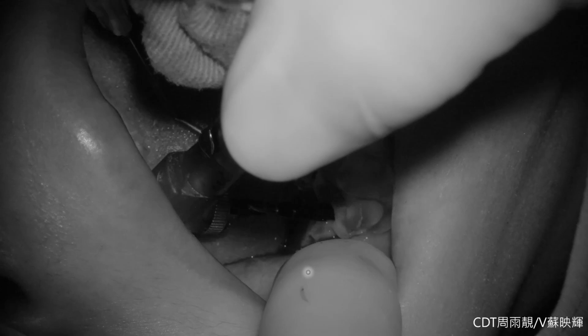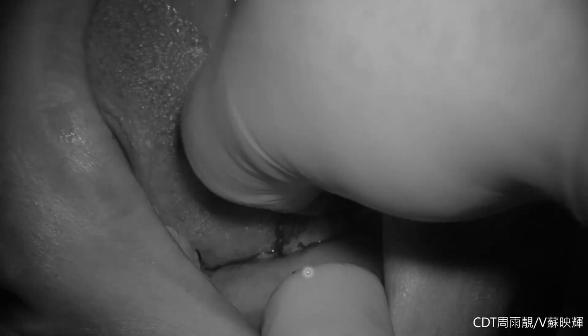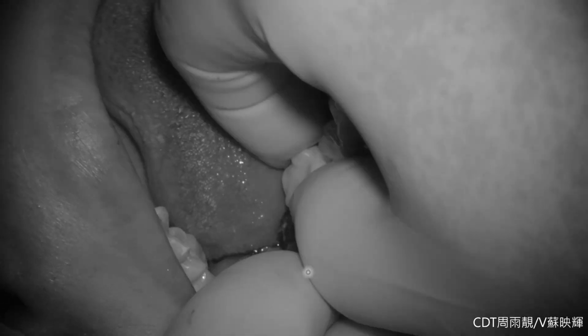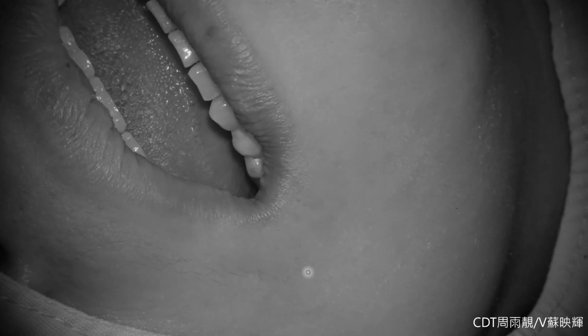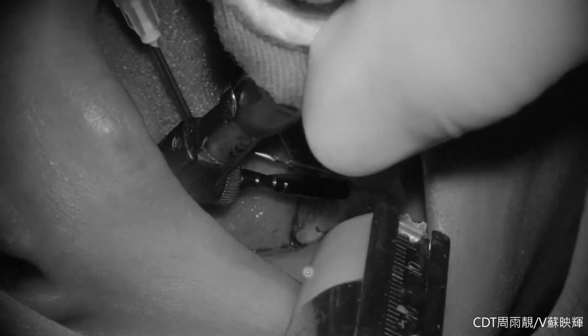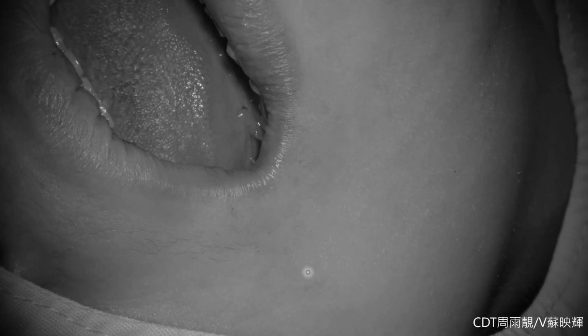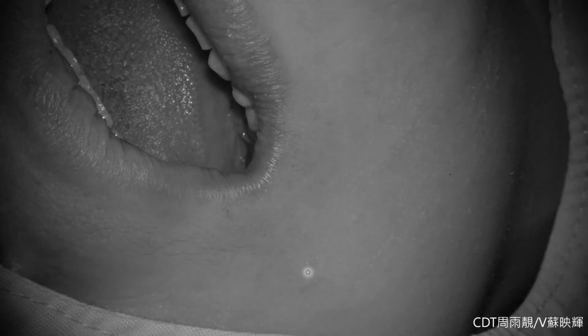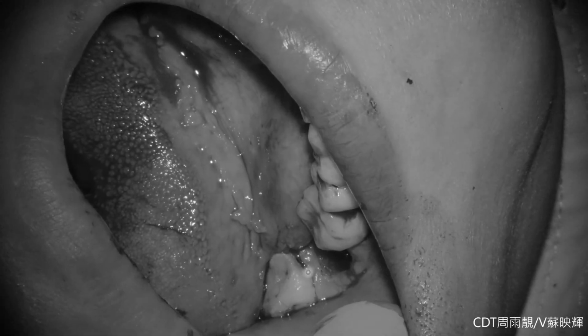So if it is not fitting, we still go to drill it and try it. And in this process, we still didn't extract the third molar yet. And then we reduce our third molar to leave the socket. The extraoral time of the third molar.